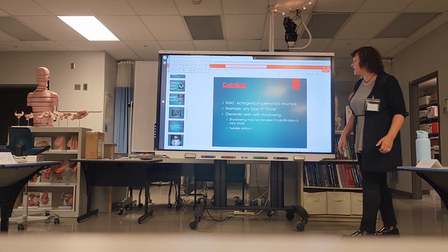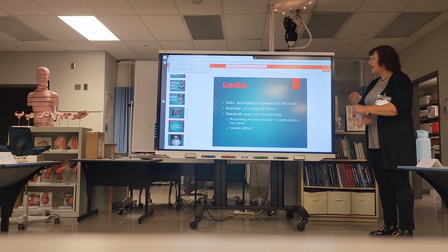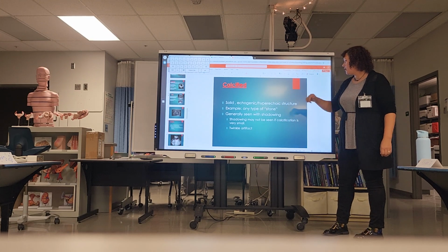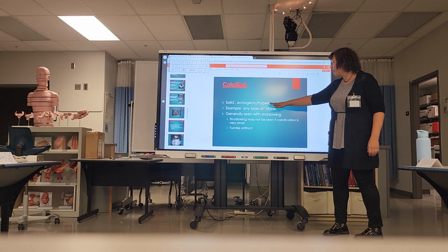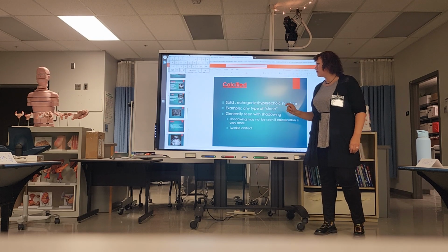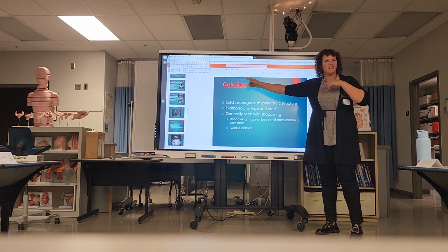Okay, calcifications. So it is a solid. A calcified structure will always be solid. It's echogenic, or you could call it hyperechoic. So a calcified structure will always be echogenic, but not every echogenic structure is calcified. Okay?